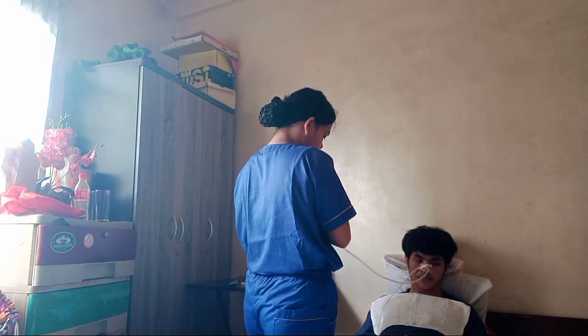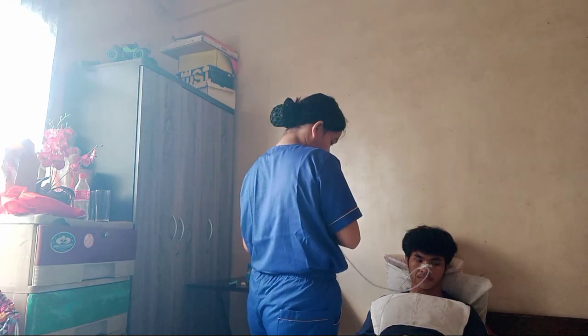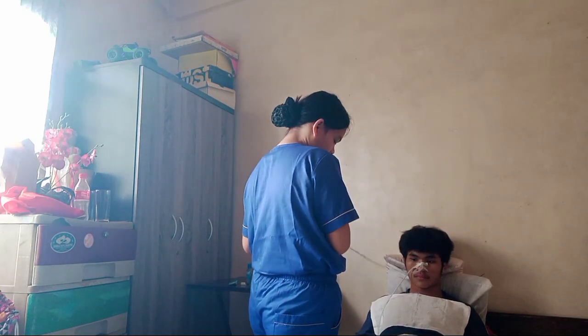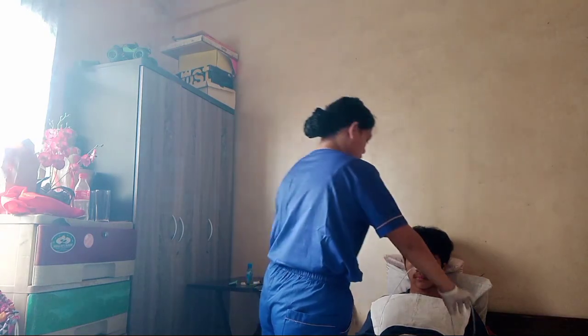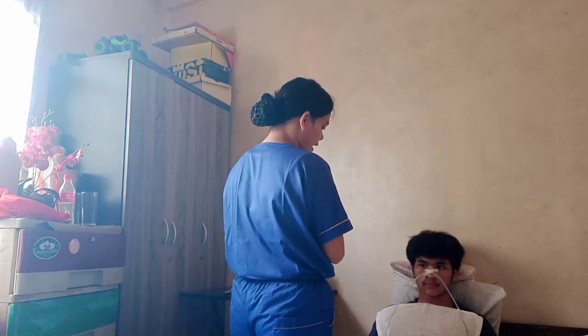Then, after that, if the tube is to be removed, clamp or pinch it. Then, remove all used equipment from the bedside.